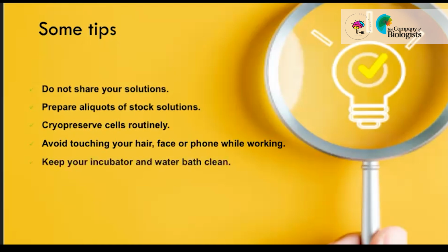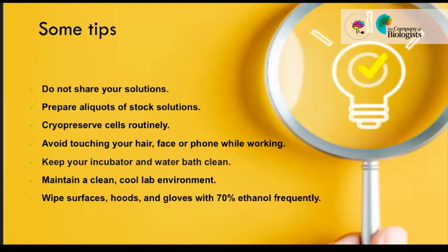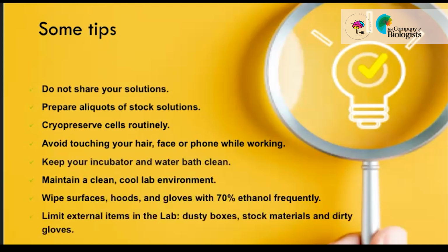Keep your incubator and the water bath clean. Maintain a clean, cool lab environment. Wipe surfaces, hoods, and gloves with 70% ethanol frequently. And limit external items in the lab, dusty boxes, stock material, and dirty gloves.